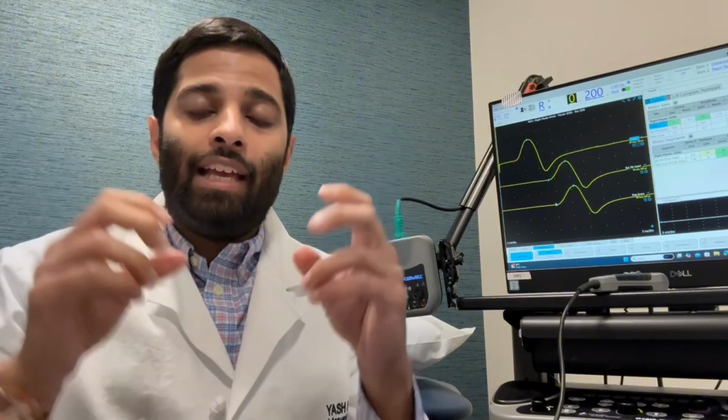And so when we test your symptomatic side, that gives us the best idea of, hey, this is truly normal or abnormal. For example, some patients may lay in the normal range, even on their symptomatic side. But if there's a significant difference between side to side, then we know even though in the population they're considered normal, for them, that's truly a pathology.